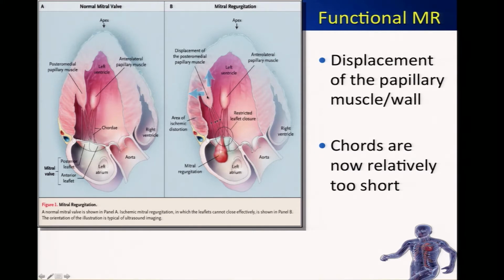So what happens here is not pap muscle ischemia or necessarily pap muscle dysfunction, it's ischemia and remodeling of the wall that the pap muscle is attached to. So the effect is that the pap muscle, in this case, is apically and laterally displaced. The cords don't get longer to compensate, so now you have this tethering, and this is a nice depiction. It's pretty small, but I'll show you an echo in a second. It shows actually the strut cord puckering that anterior leaflet.